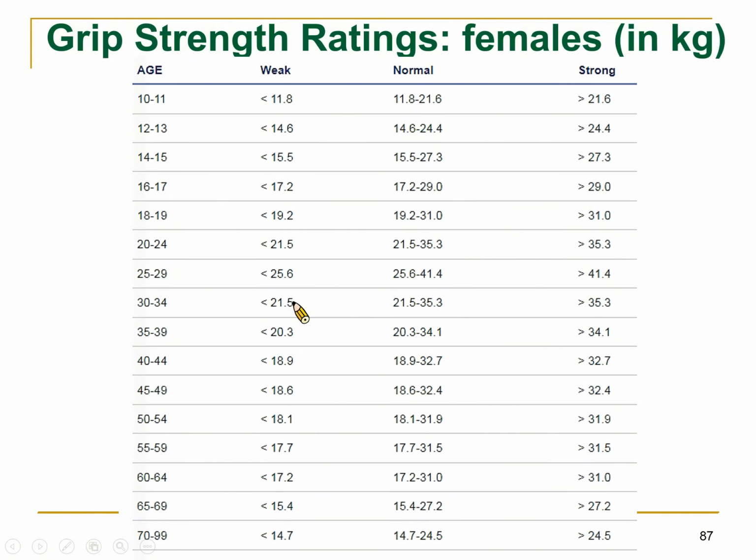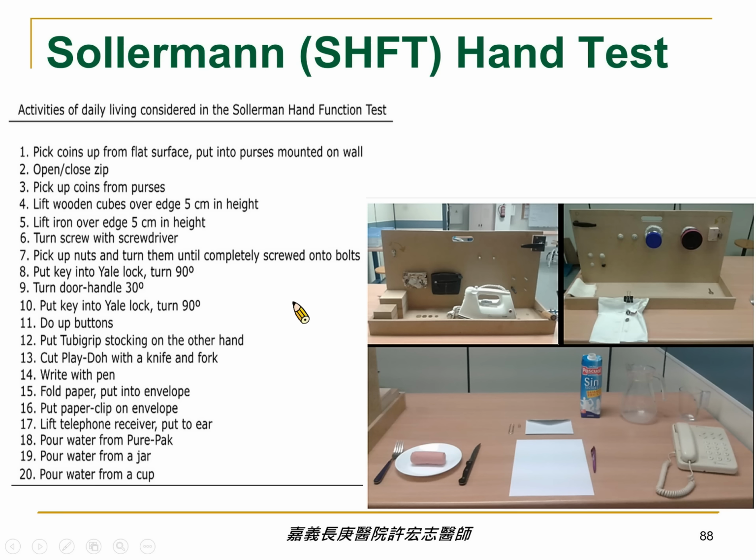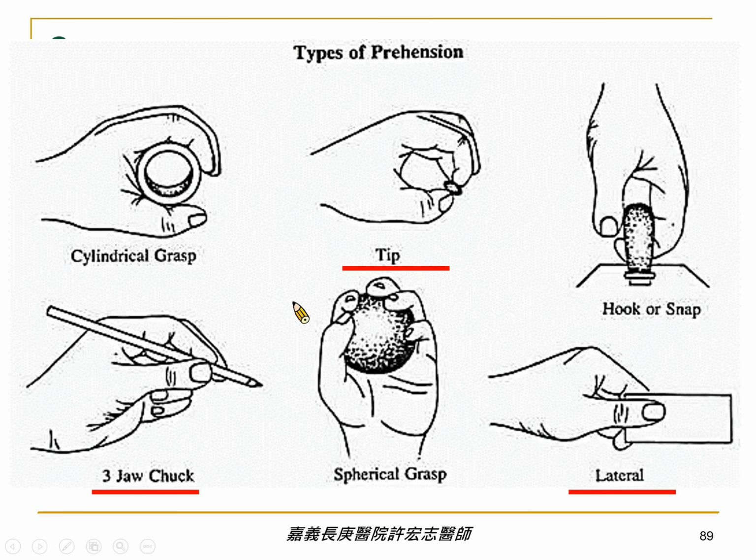Okay, if you are weak, don't worry, you have to train your muscle power. What muscle power? Grasping muscle power. Okay, if you are normal, congratulations, you can keep it that way. But how come you are strong? You are strong. Remember not to squeeze your classmates too hard. Okay? OK, 这是 grasping function，好不好？大家自己有左手有右手。OK, this is the rating of your grip strength.